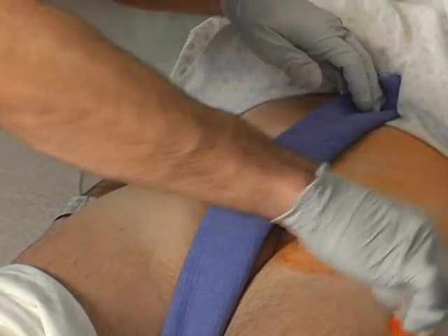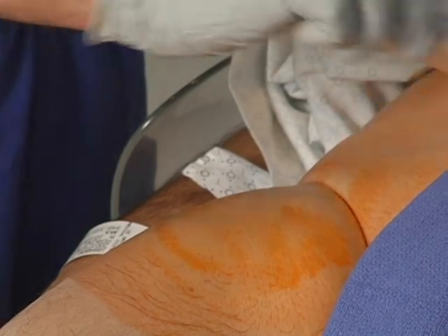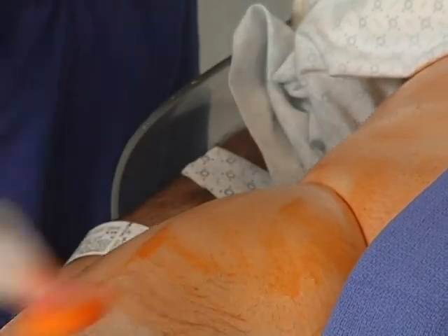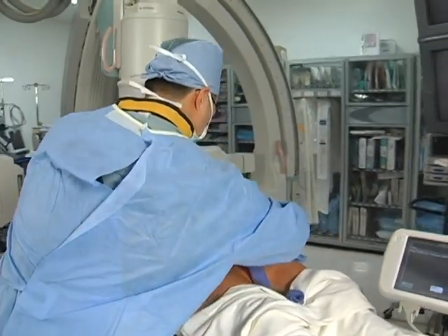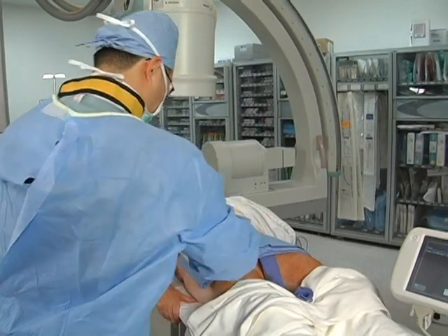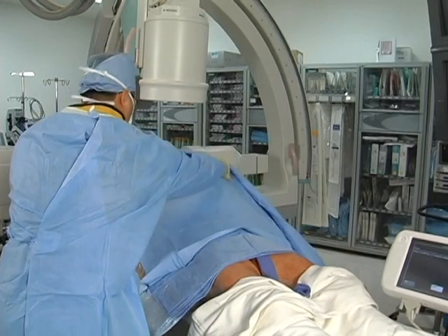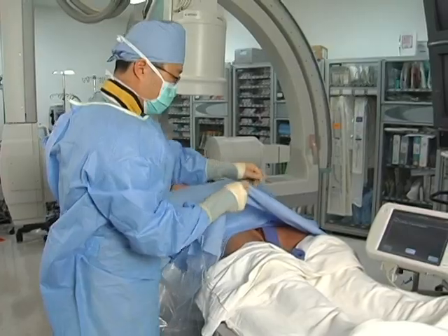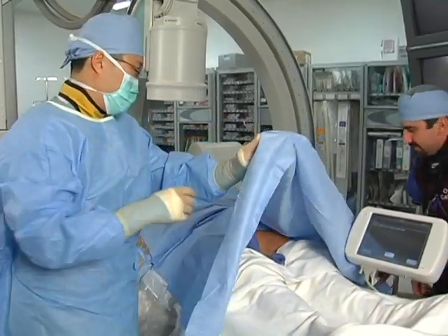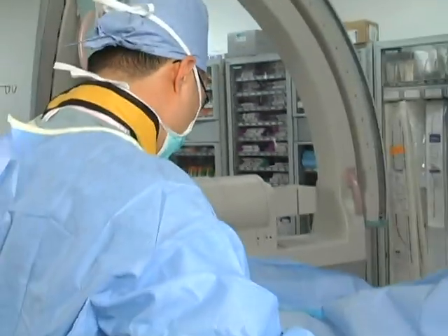Sterile technique for applying the chloroprep is used for both sides, and the drapes will then be applied by the sterile scrub tech. The sterile drapes have 2 holes cut in them, which are positioned directly over both femoral arteries. These holes permit access to the skin with minimal exposure of any other area. Assistants drape the entire table so that there is no area of the operating field which is not sterile.